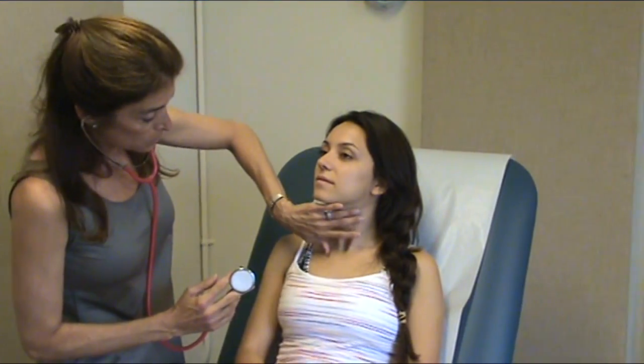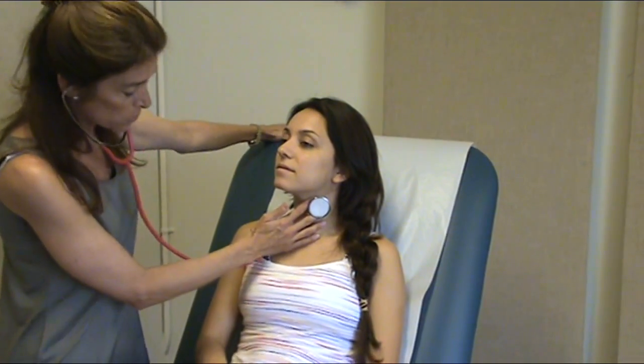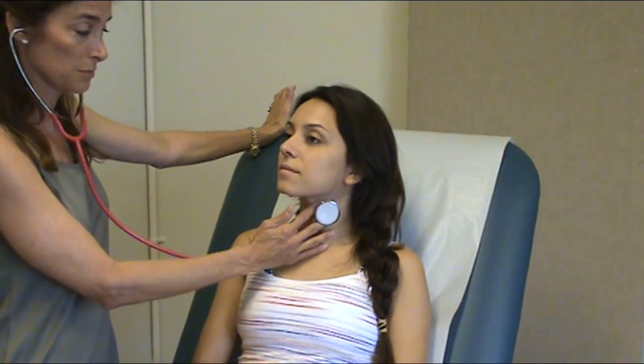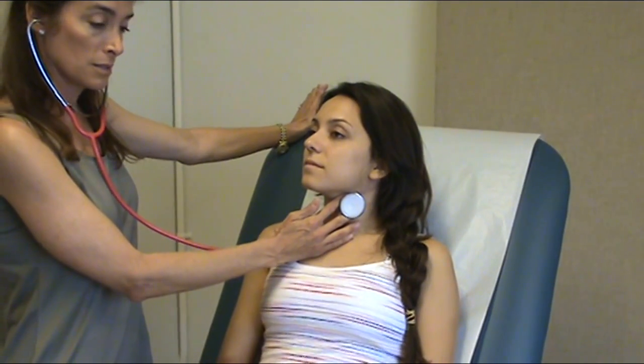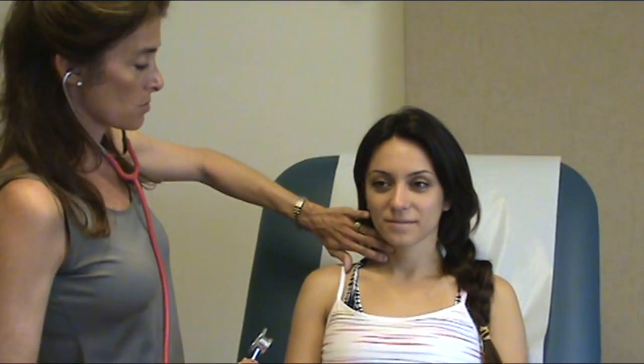You're going to palpate the carotid. You're going to place the bell of the stethoscope over the carotid artery. Ask your patient to take a deep breath and hold it. And then listen. You should not hear anything, and then you may release. Then you have to do it on the other side as well.